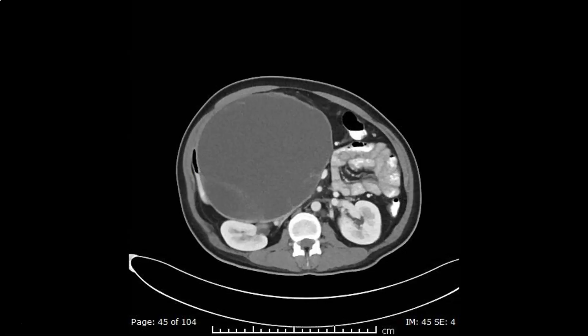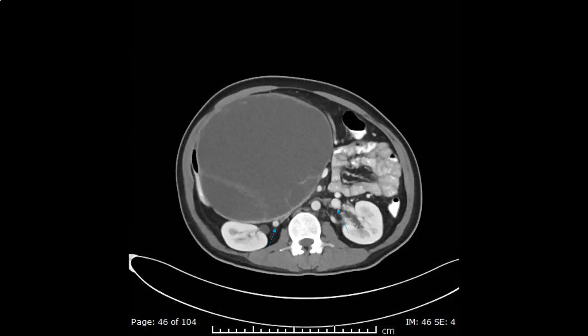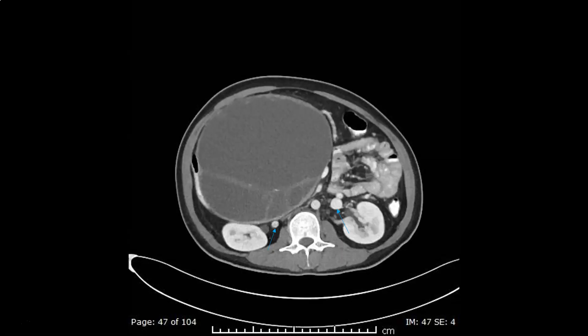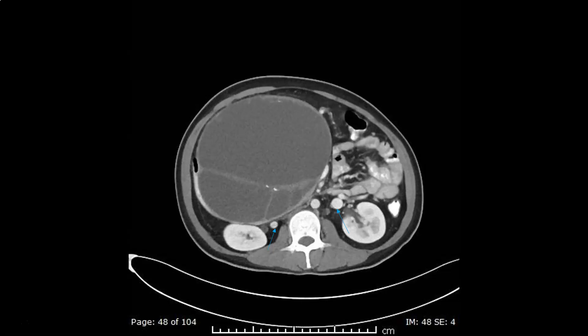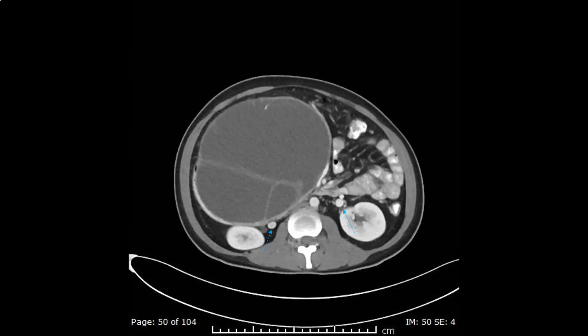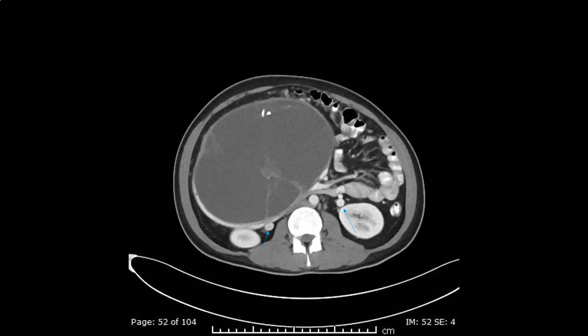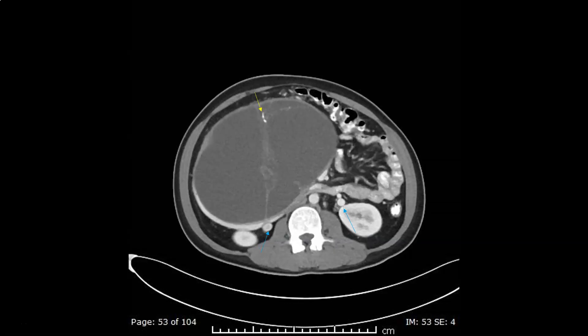We still see the duodenum immediately inferior to the renal veins. On both sides we see large veins going vertically — these are the ovarian veins. Here we see the calcifications within the septations inside the lesion.